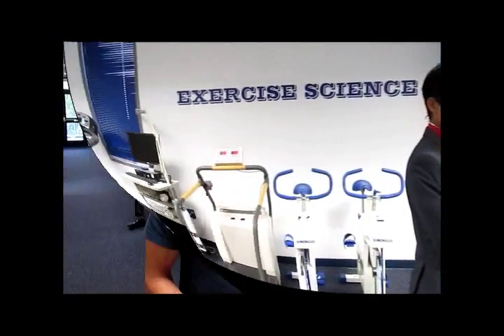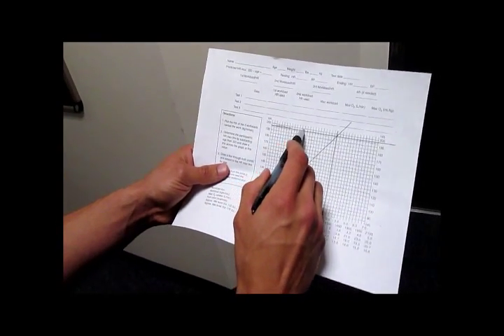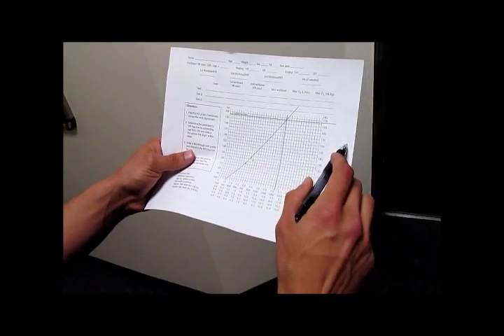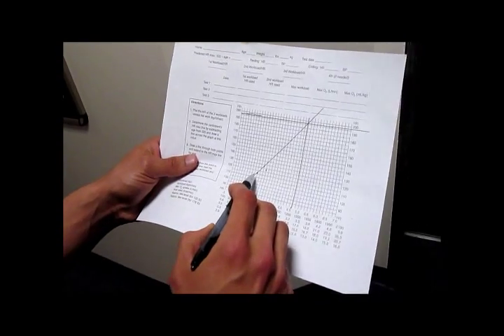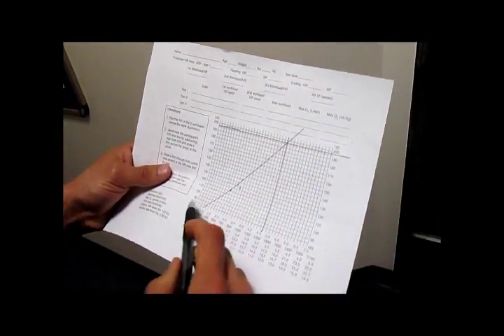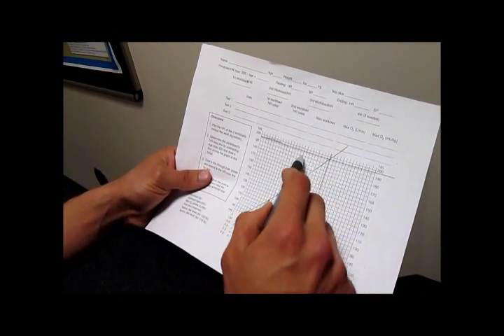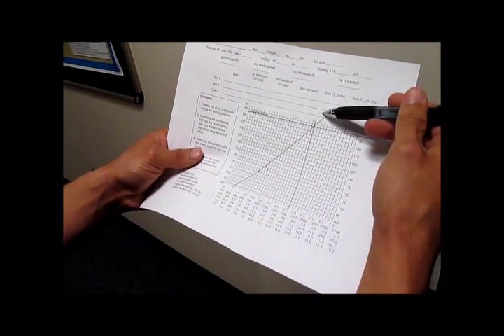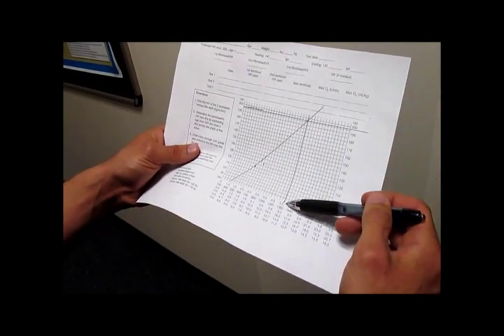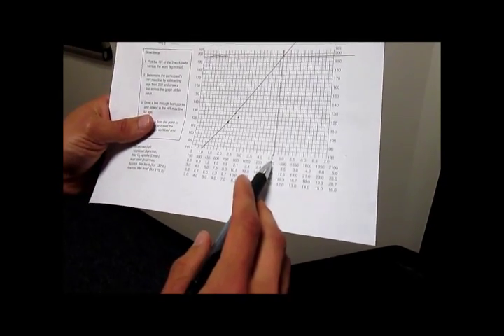After finishing the YMCA cycle test, here are the results. I measured out my two steady-state heart rates from the last two consecutive stages and drew a line going across the graph at a heart rate of 196, connecting to the age-predicted heart rate max. Then draw a line straight down, and that measures the 4.6 maximum oxygen uptake.